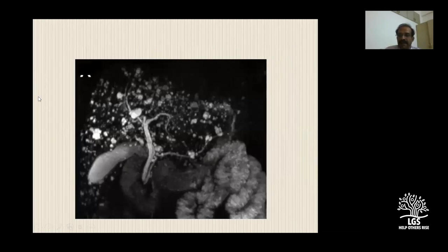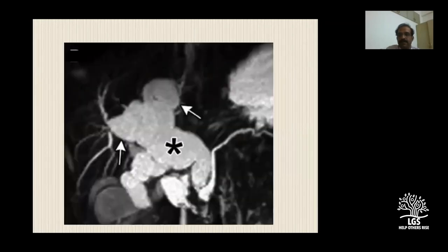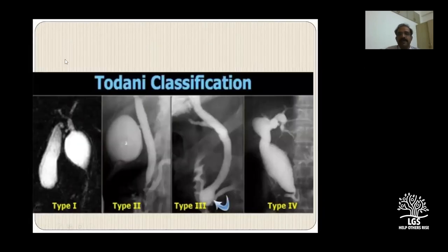For congenital abnormalities - this image looks like a starry sky. It's called Caroli's disease, where there is congenital dilatation of the biliary radicals. All these biliary radicals appear very bright on T2. Congenital conditions like choledochal cysts are also very well demonstrated on MRCP.